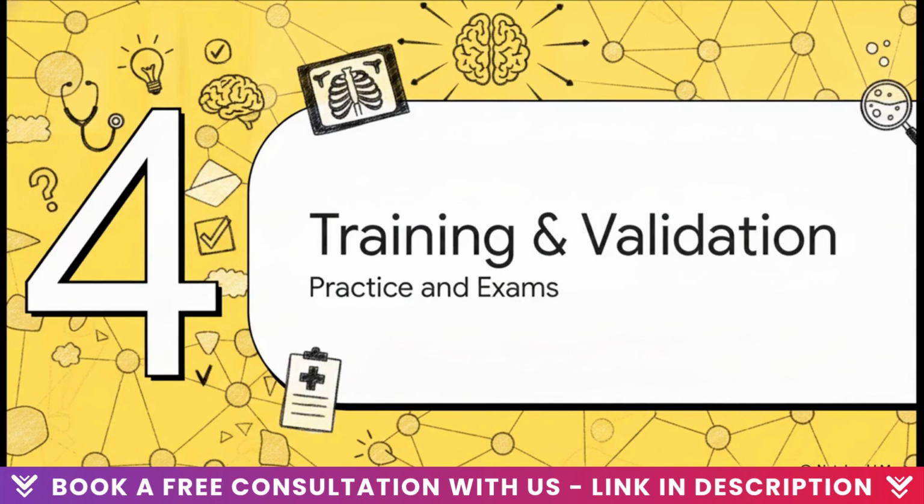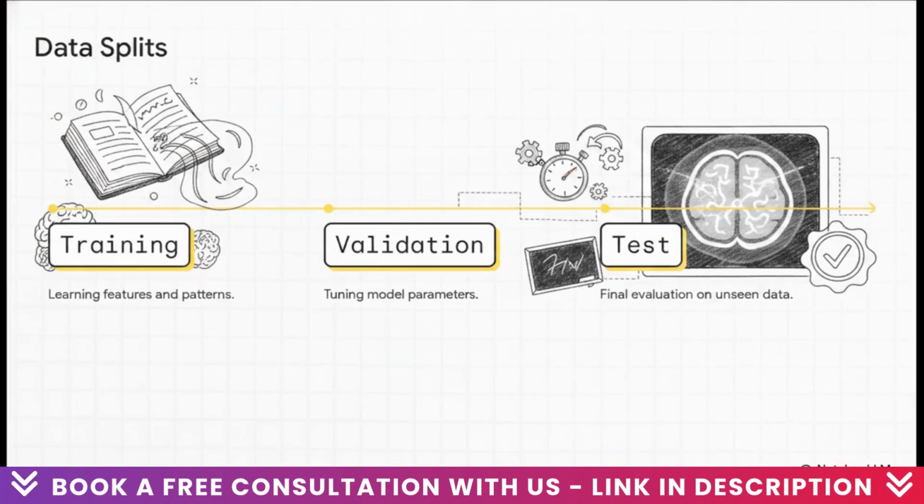Let's move to step 4 and see how this all builds up into training and validation, basically practice and exams. So the engine is built, right? Now it's time for the AI to study for its medical boards. To do this safely, we have to split our data up really carefully, a lot like a student preparing for a massive test. We use the bulk of our scans as training data. Think of this as the textbook the AI uses to learn features and patterns.